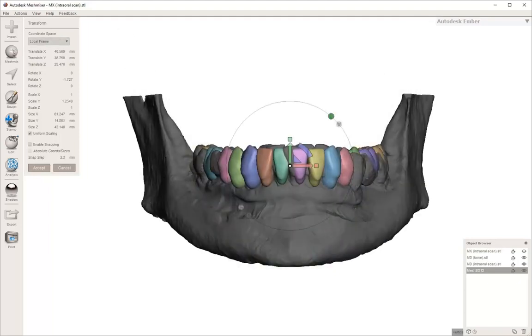You're just going to use those transform tools and, in general, get the arch set up to how the patient's arches.